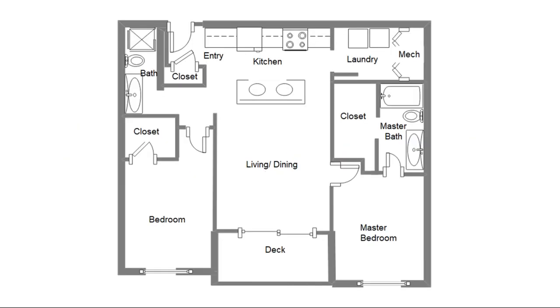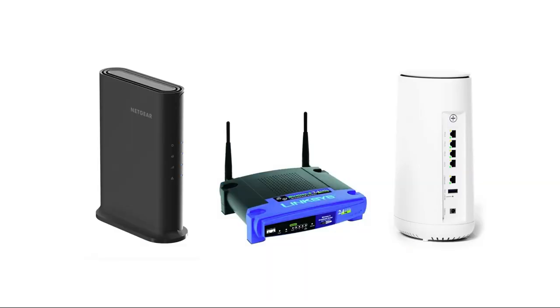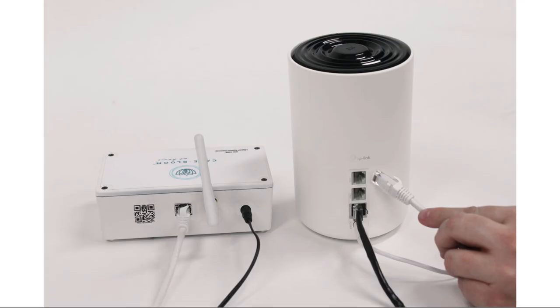Before your kid arrives, we find that it's helpful to begin planning for setup. Every home has a different layout, so we put together our list of tips and tricks to get the most out of CareBloom. First, you'll need to connect the gateway to the internet, so make sure you locate the router or modem ahead of time. We provide all of the cables, so an open port is all that you need.